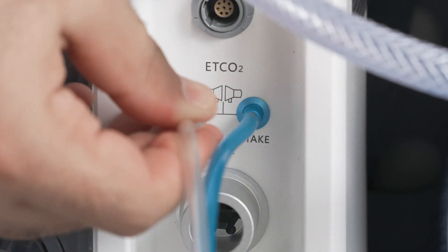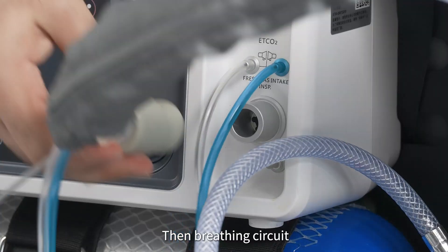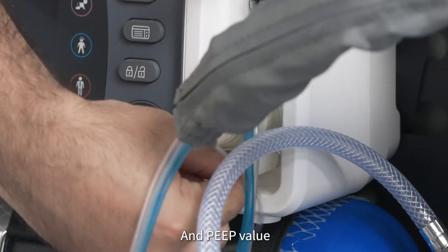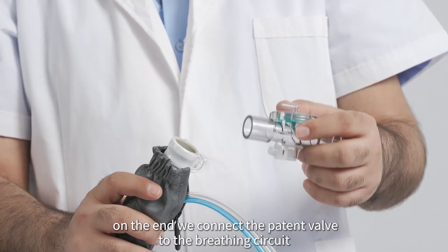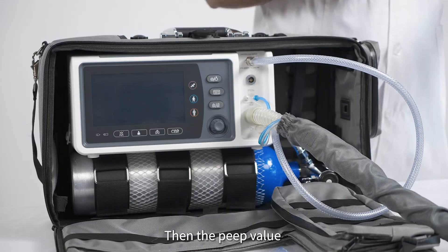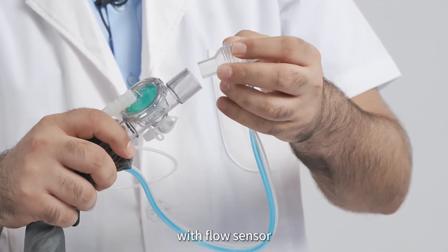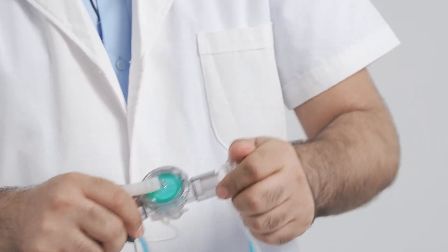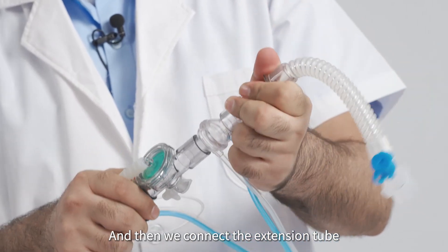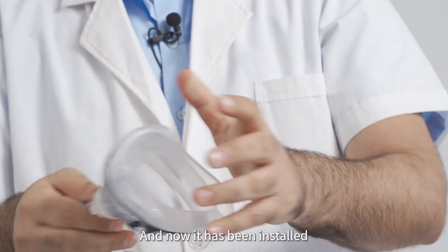Connect according to the colors: blue into blue and white into white. Then connect the breathing circuit and patient valve. Connect the patient valve to the breathing circuit, then the patient valve with flow sensor. Then connect the extension tube and the patient mask. The device is now installed.